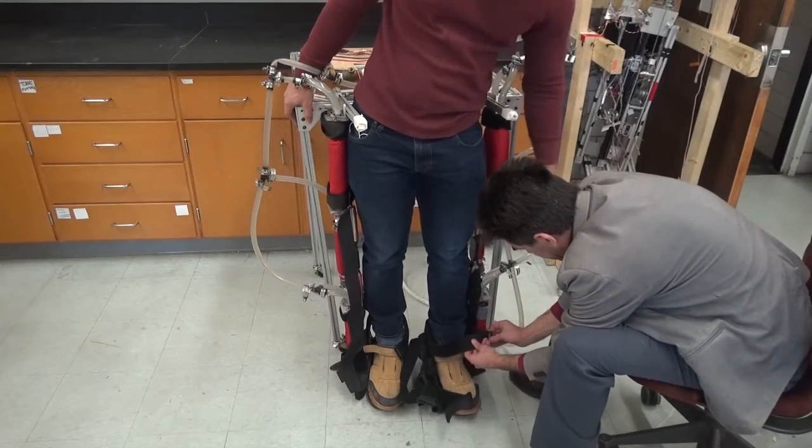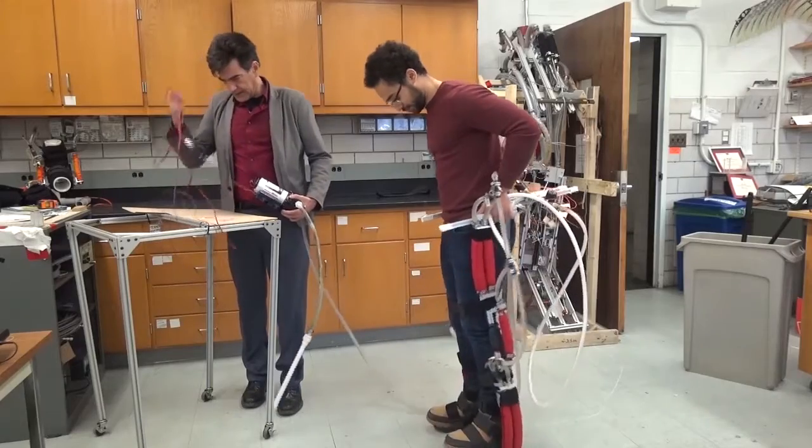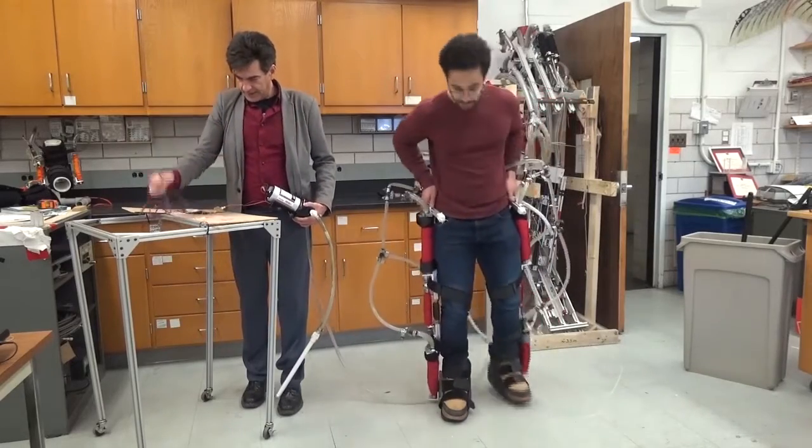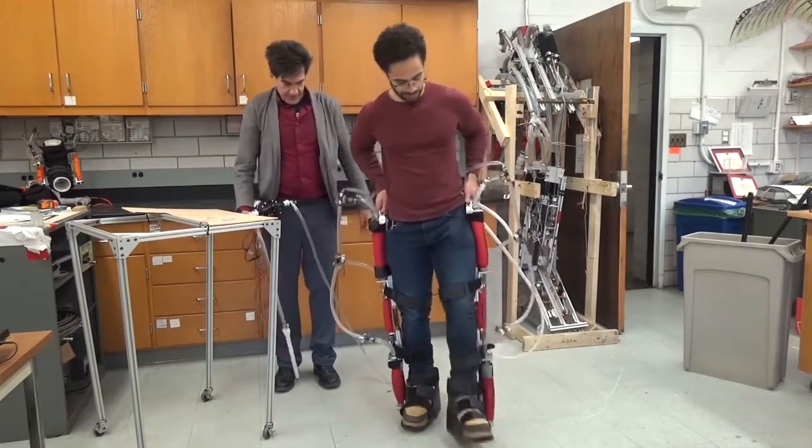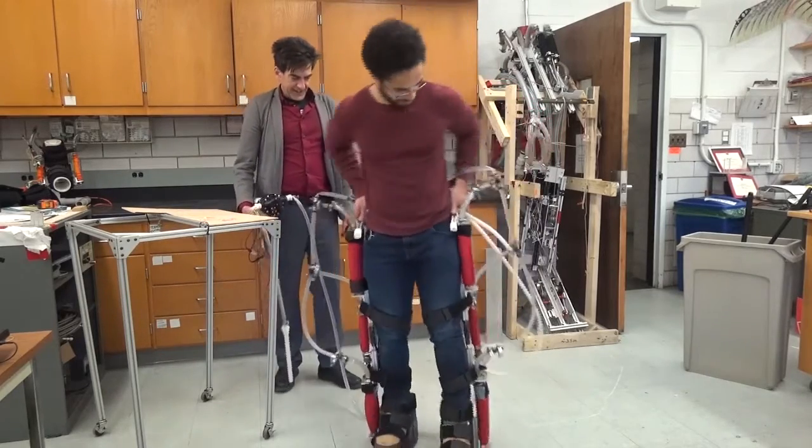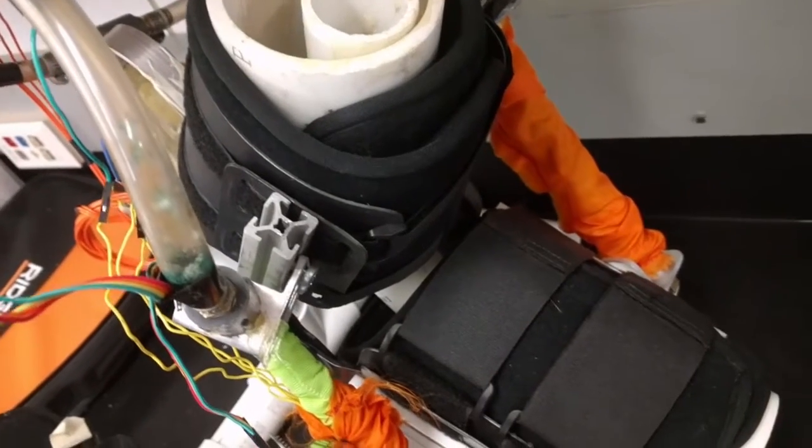Hydrobone, invented in Popovich Labs, allows for column compressive stiffness modulation by varying fluid pressure within rubber core, which affects the mean inter-particle distance within outer layer consisting of elastic granular media. One application is lower limb exoskeletons.